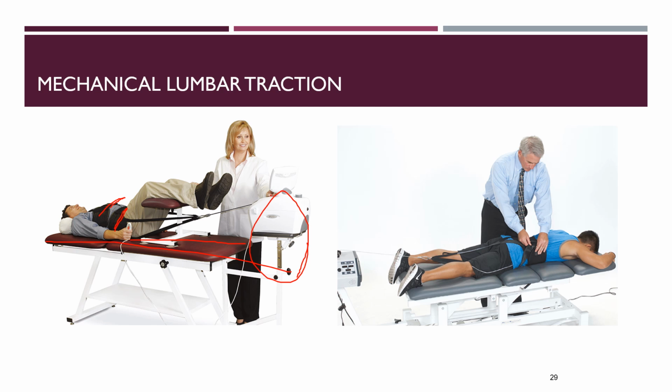For this one on the right-hand side, this person is in prone. Remember we talked about the flexion and the extension bias earlier. If this person injured themselves by bending forward and lifting something heavy, then they're more than likely going to fall into what we call an extension bias, which just means they like the extension position better because it's reducing pressure on those different structures that we mentioned earlier.